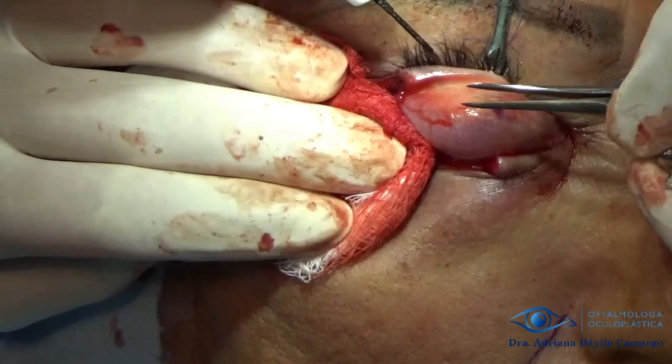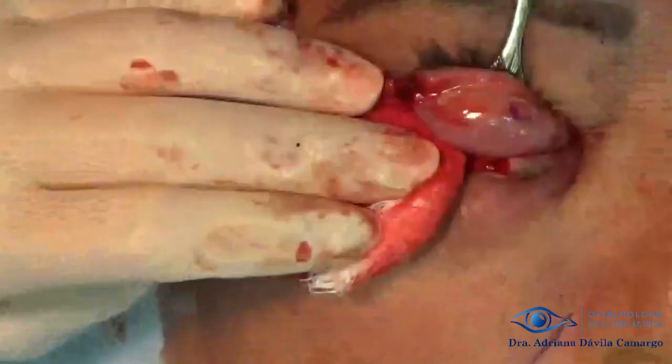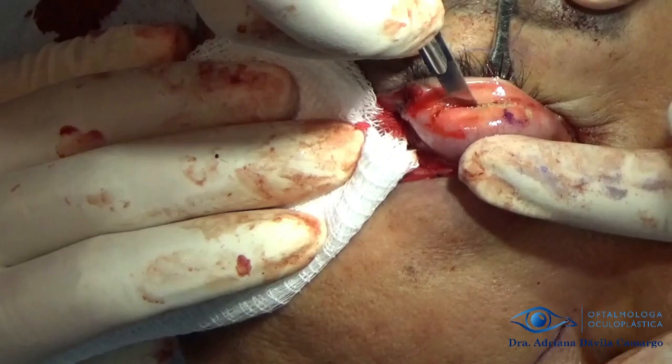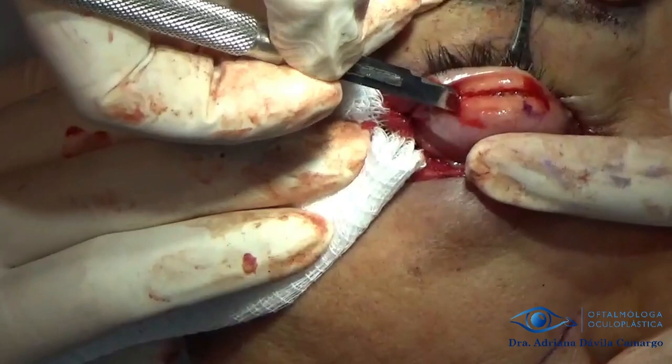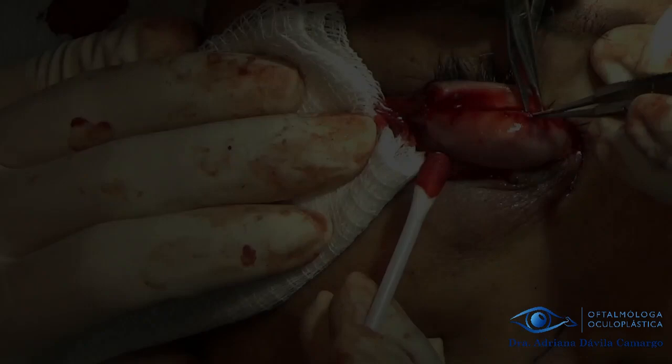With the scalpel we dissect the conjunctiva and tarsus, and with forceps and scissors I proceed to dissect the conjunctiva and tarsus from the upper portion, which is what we are going to place on the lower eyelid. We need to leave at least 6mm on the upper eyelid margin so that it maintains its shape and has support. It must be remembered that the upper tarsus measures 10mm.